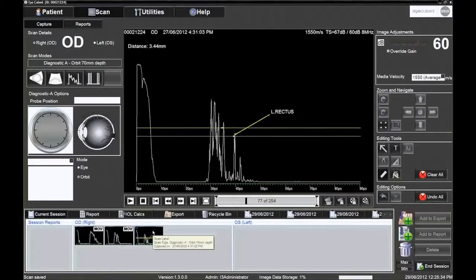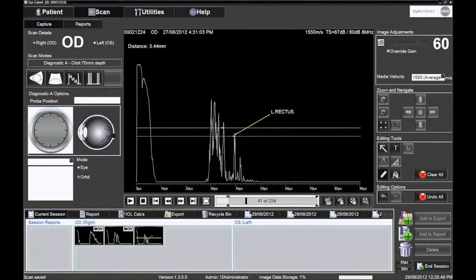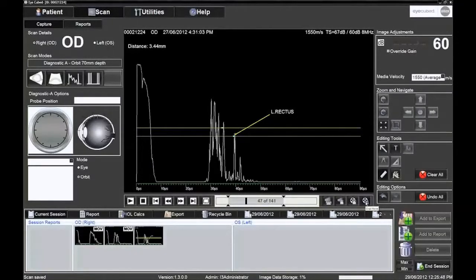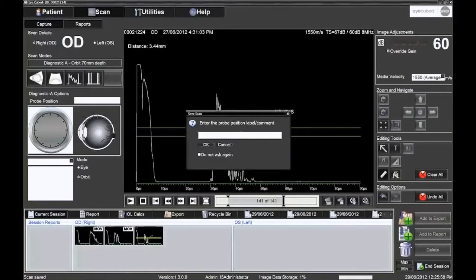A movie can also be stored. In order to save memory space, it is best to crop the sequence and only save useful images. Shorten the sequence by sliding the end markers along the bar and click on the fourth icon, Crop Movie, before clicking on the third icon to save it.